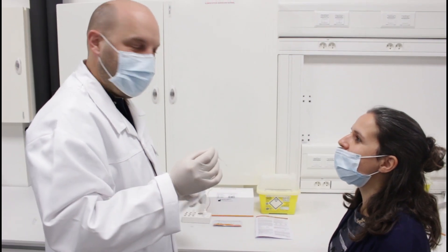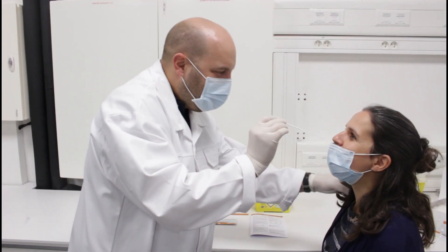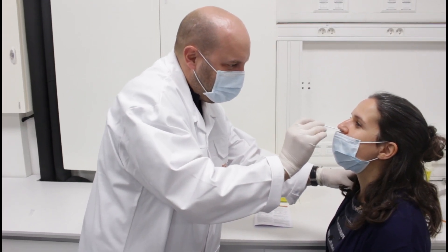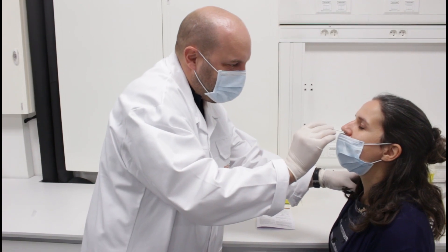In order to collect the sample, carefully insert the swab horizontally into the nostril of the patient until you reach the surface of the posterior nasopharynx.